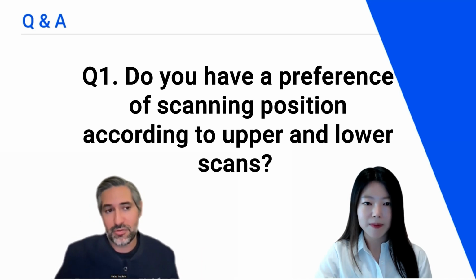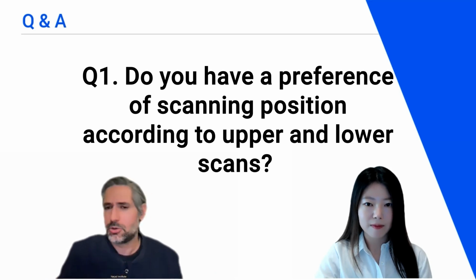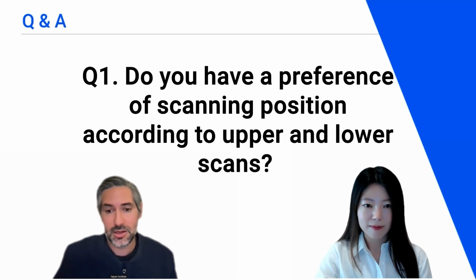Of course, it's all preference, but I think 9 to 12, even my assistant does it pretty much the same. She does it on her side. Actually, no, she comes around to my side when she scans. Anytime she can, she comes to my side and does the same thing. And she stands so she can have the same positions.